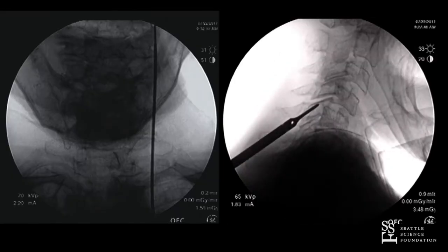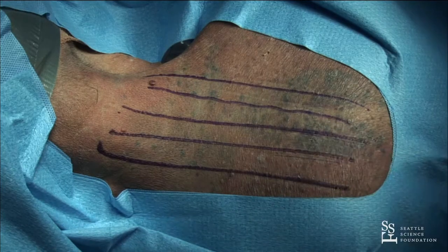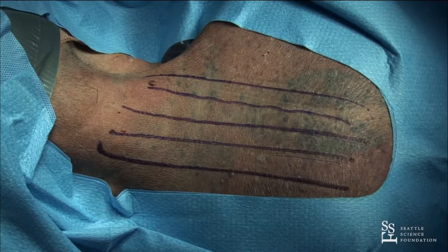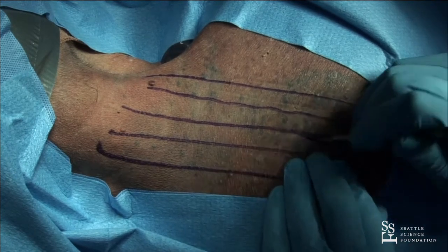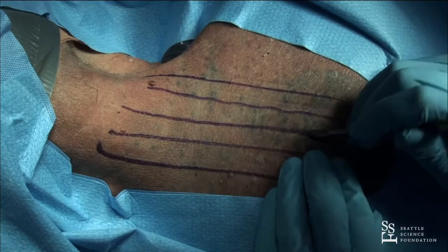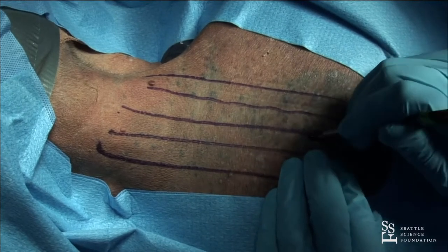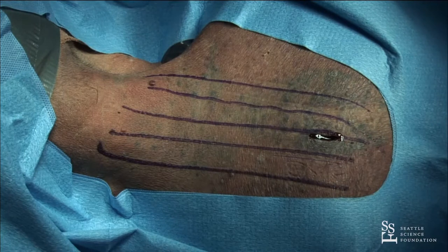You can see I can get to that facet pretty well, and I have an idea in terms of up-down where to make my incision. Generally the incision is just off midline, two to three levels below the intended segment. The way I do this is I incise the skin, incise the ligamentum nuchae, and reflect the muscles laterally — the same as you would do with a standard open incision.